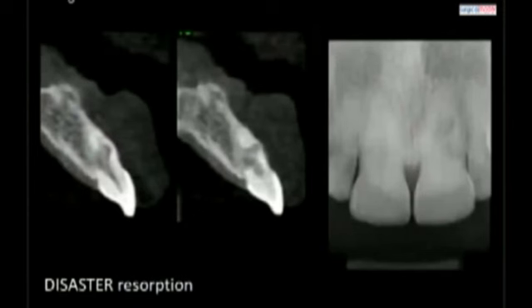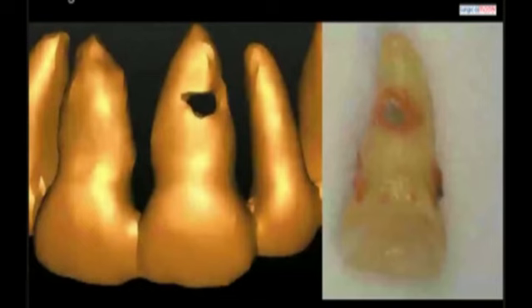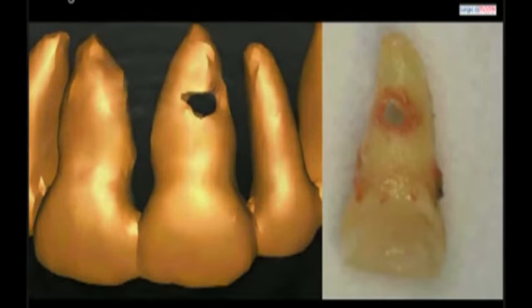And this is a case of an immediate placement of replacing a resorbed tooth, central incisor. Okay, and again, I didn't need to use the Benex here. The tooth was completely intact. You can see the resorption. Once the tooth gets pulverized, there's a very simple principle that you're getting double the volume. So you're getting a lot of bone graft material.